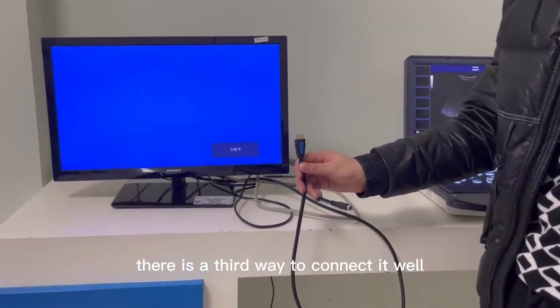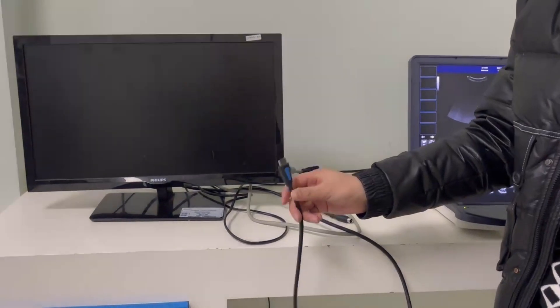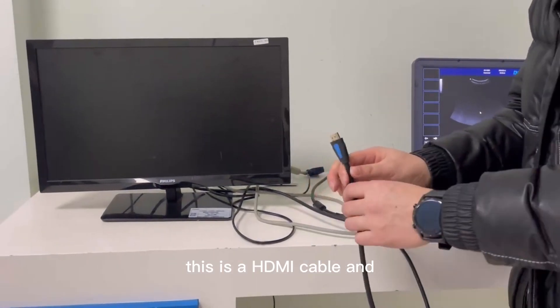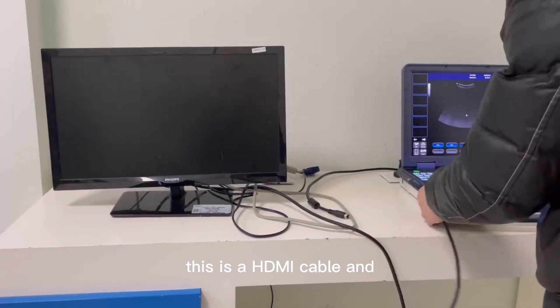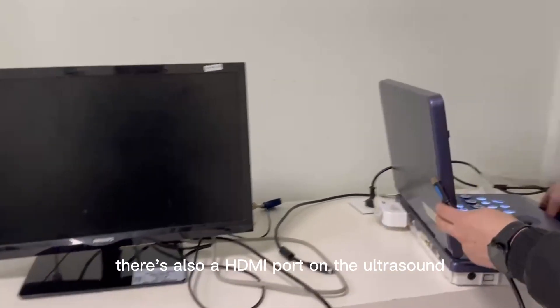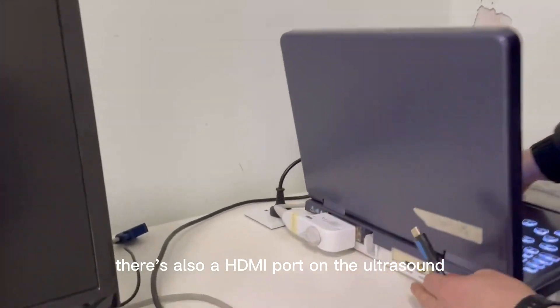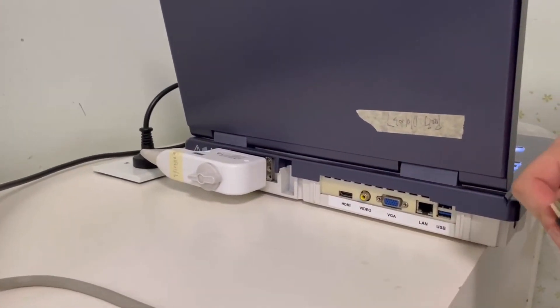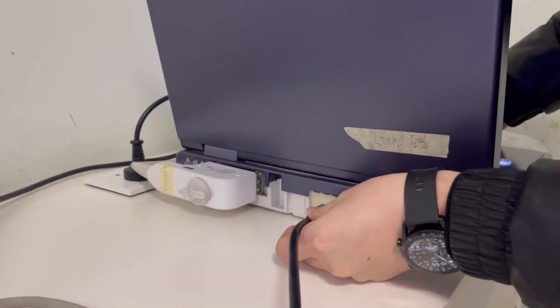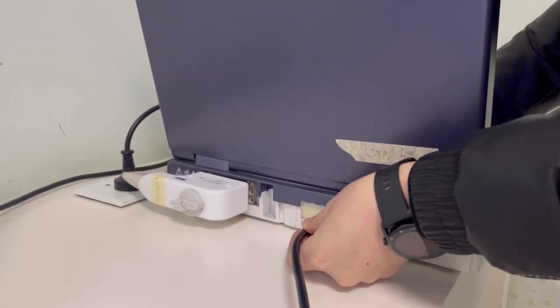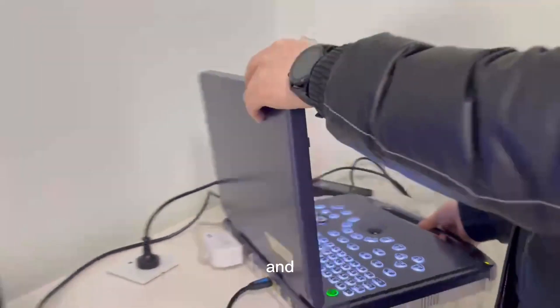There is a third way to connect it. This is an HDMI cable, and there is also an HDMI port on the ultrasound. Just connect it.